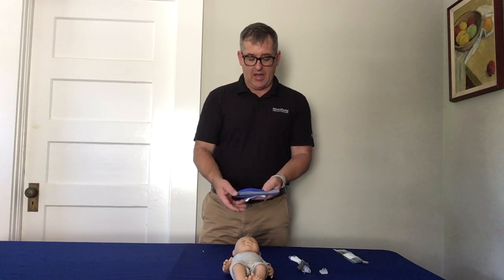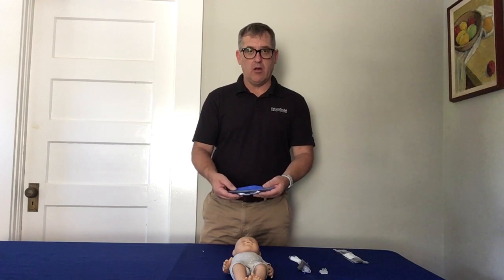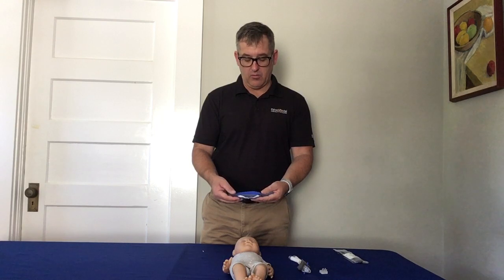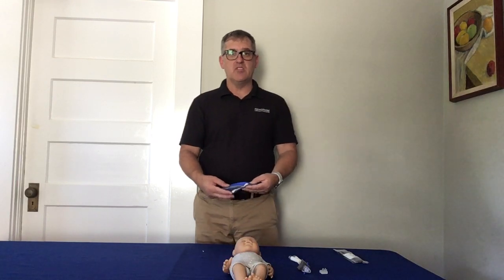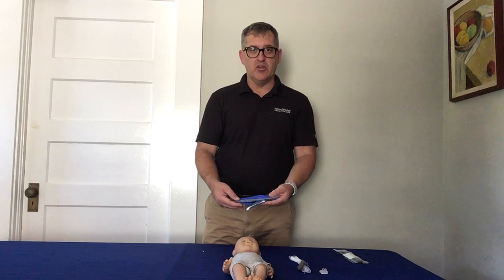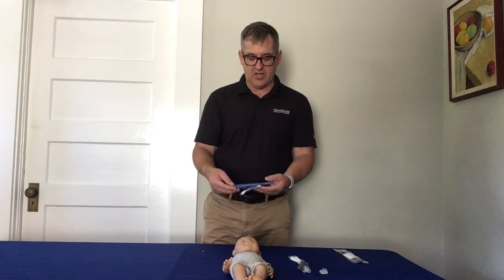With this headgear, what you'll find is that headgear has considerably more aggressive Velcro. So I'm going to show you a technique to put this on so that the Velcro doesn't get in your way and doesn't chafe on the baby itself. So right now, first things first, you're going to take a circumference of the baby's head just like you would when using the bonnet. My baby here is 32 centimeters around and my headgear is 29 to 36.